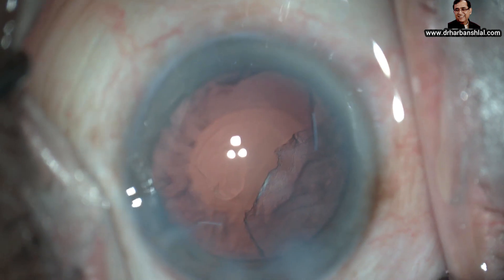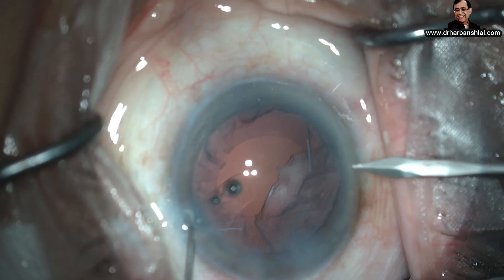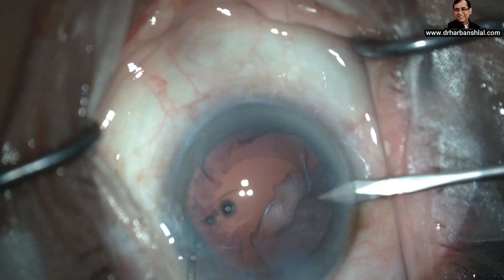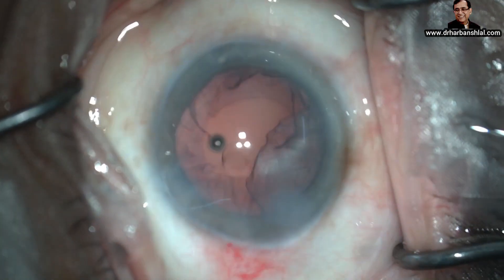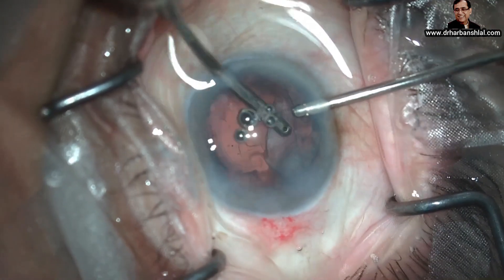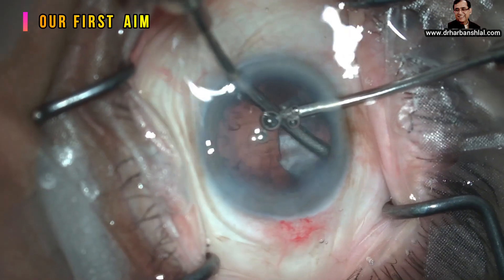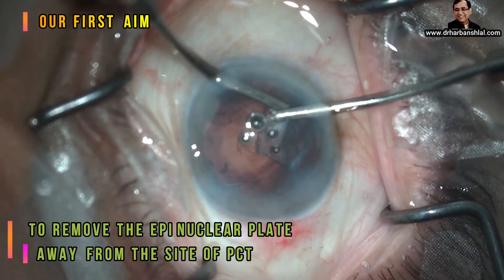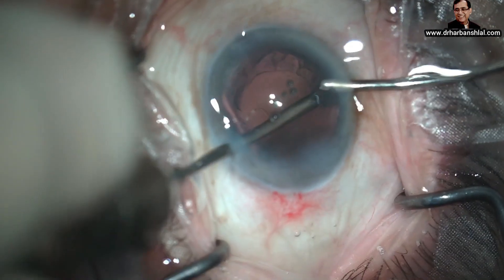Make two side port incisions away from the site of PCT. The vitreous has a tendency to prolapse towards the incision. Therefore, we remove the cortex and epinuclear plate away from the site of PCT where there is the least possibility of vitreous presence. Our first aim is to remove the epinuclear plate that is away from the site of PCT, because the epinuclear plate has a tendency to drop into the vitreous cavity.